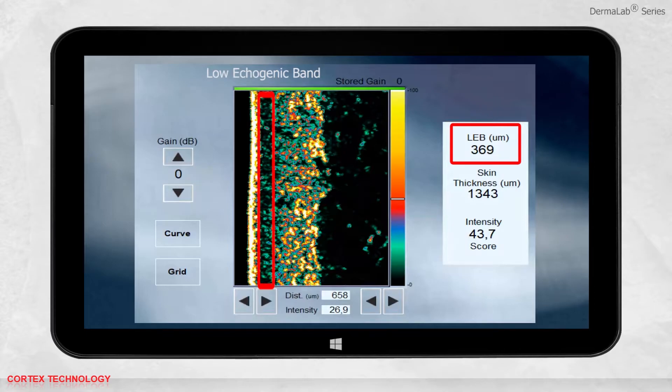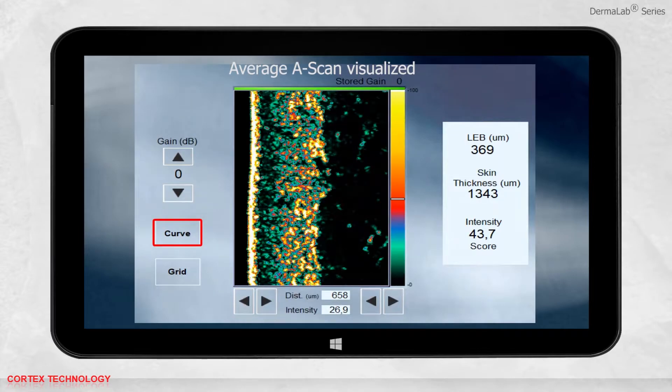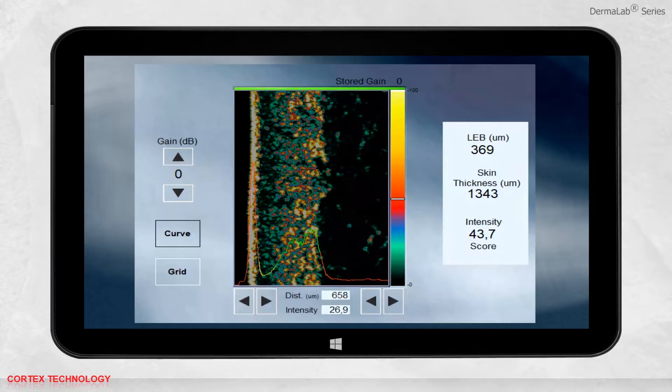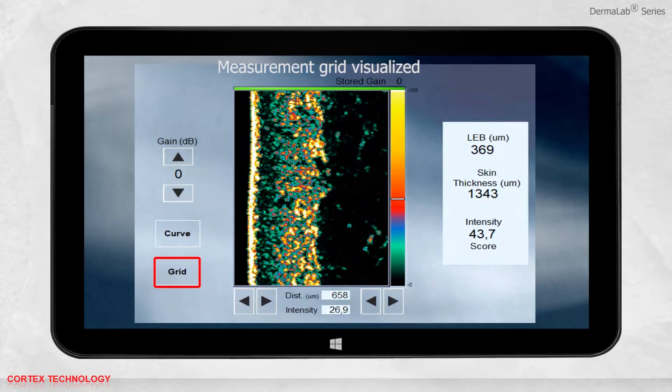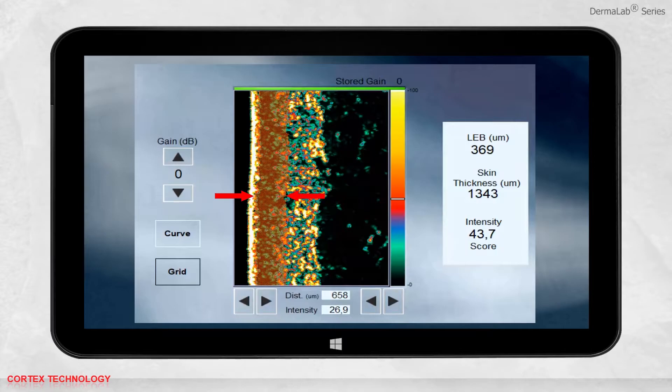The low echogenic band relates to a weakening of the reflected signal in the upper dermis, typically caused by degenerated collagen. The thickness of the LEB is expressed in micrometers. The automatic measurements are derived from the average A-scan, which may be visualized by pressing curve. LEB refers to the yellow part, and skin thickness to the green and yellow part combined. Manual measurements are distance expressed in micrometers and intensity within a confined area, performed within a measurement grid.